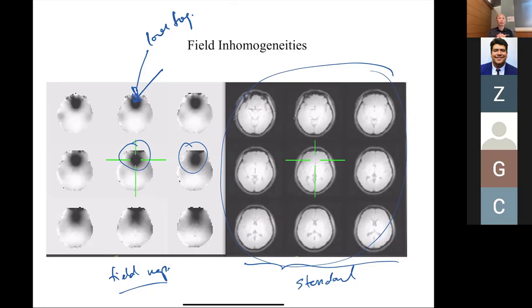Yeah, question. How do you collect these? It's a good question. There's something called a field map acquisition where we acquire the data at two different echo times, and then we look at the phase that's accumulated. If it's zero phase, then there's no added frequency, and a spin will stay here. But if there's any change, we can measure the phase. So we measure the phase of the spin, and the phase of the spin tells us how much frequency offset there was. So that's a very practical application of understanding phase.